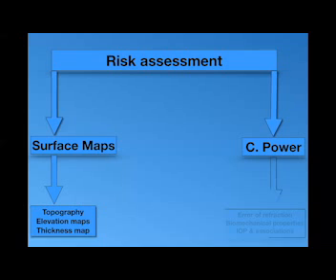And the corneal power is related to the error of refraction, the biomechanical properties, intraocular pressure, and associations related to the corneal tissue itself. If there is a scar, if there is thinning, if there is a post-trachomatous pannus, if there is corneal vascularization, the old tissue changes.